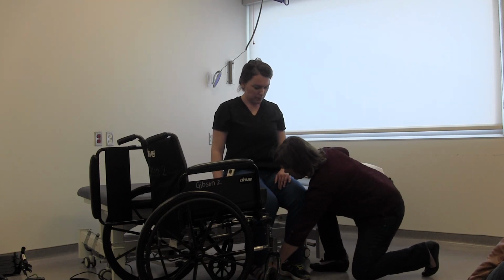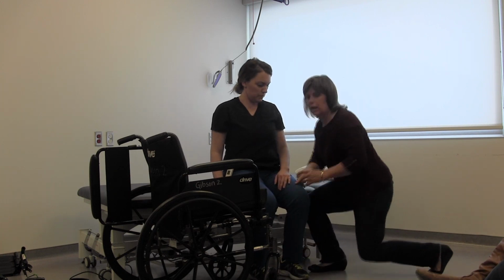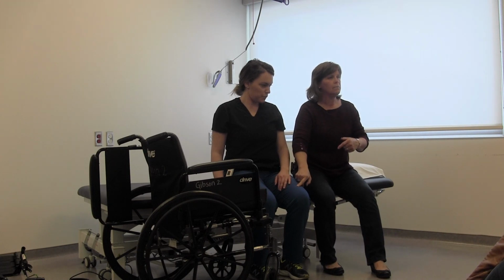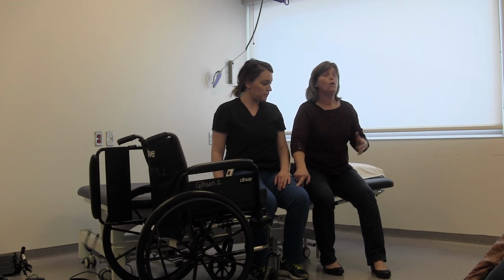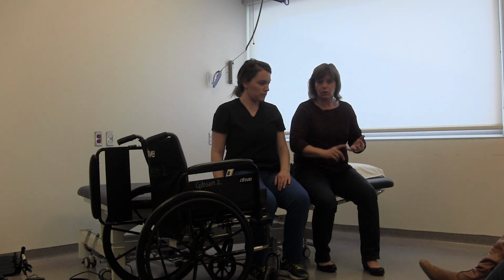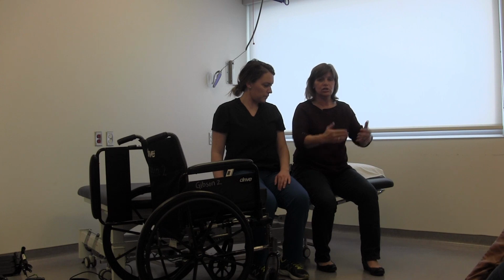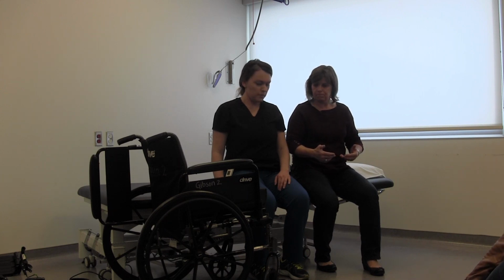Her feet look pretty good. We're just going to bring them back. Now, the odd time you might find that you can't get the patient's feet back as far as you want to, or one you can get back far and the other you can't. It could be tight heel cords. It could be someone who fractured their ankle in the past. Just bring their feet back as far as you can, okay?